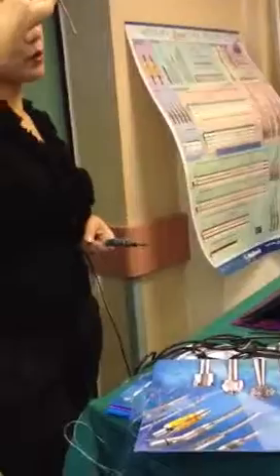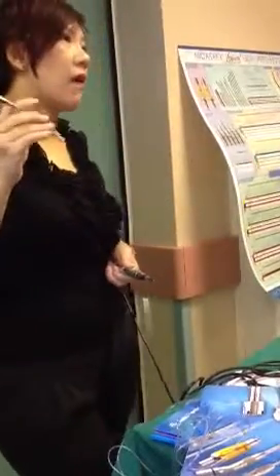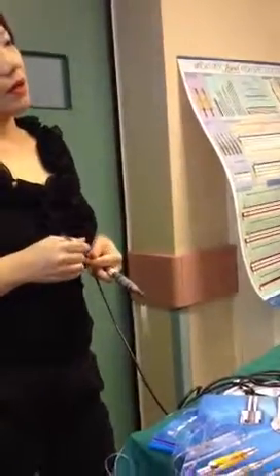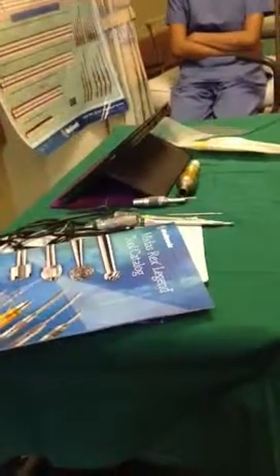On the other hand, this telescopic attachment is recommended for 20 times of use only, sister. Then you have to replace it, because it runs at 70,000 RPM. How do you recommend we keep track of the number of uses? Well, how do you keep track? We write on it with a marker, each time we use it, so after 20 times we know it's up. Or there is a sticker, like our ultrasound Doppler, they provide stickers. This time you use a sticker, so we know, and this time it's finished.